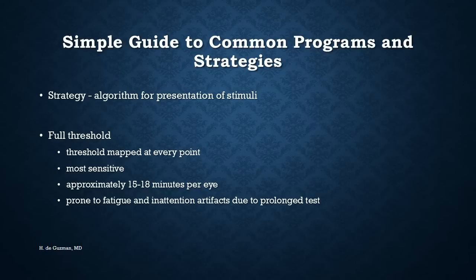I recommend that every ophthalmologist should do a visual field test so that we know what it feels like and we know what we are putting our patients through every time we send them for a visual field test.